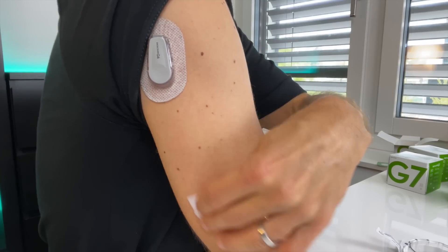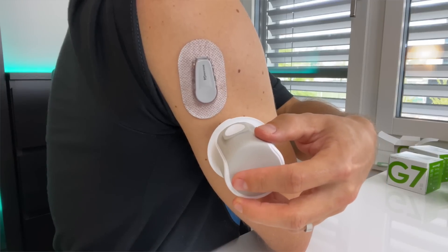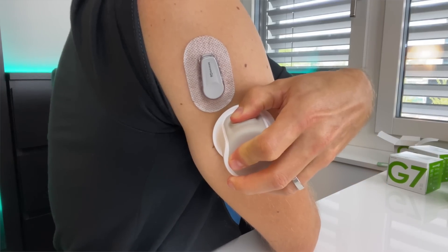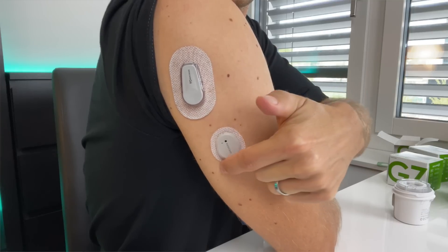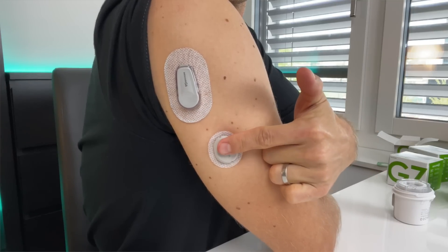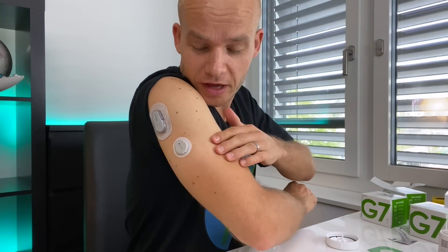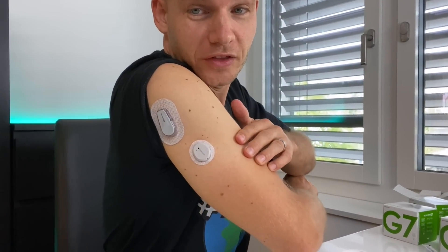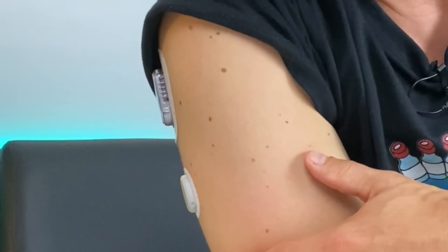Dexcom, could you please make this clearer? Clean the site with an alcohol wipe, wait until it's dry, unscrew the cap from the applicator, hold the applicator firmly against your skin and push the button. Wrap around the patch three times and gently press on the top of the sensor for 10 seconds — I guess to make the sensor stick better. When you compare the size of the G6 and the G7, the G7 is really a lot smaller and not as bulky.